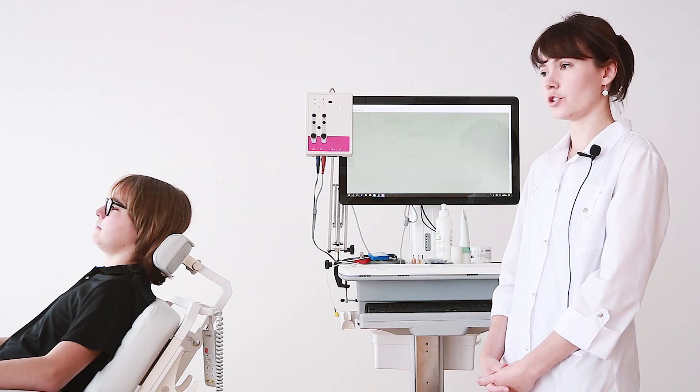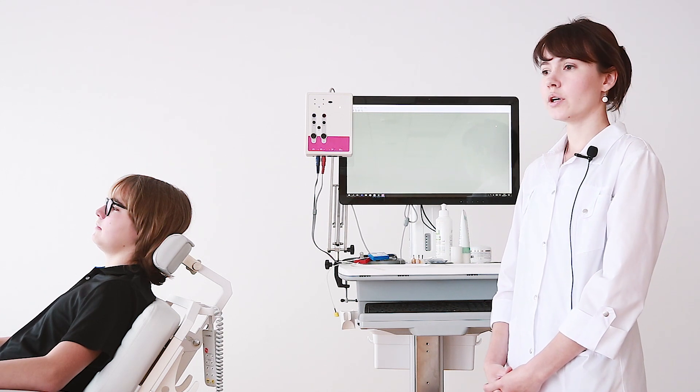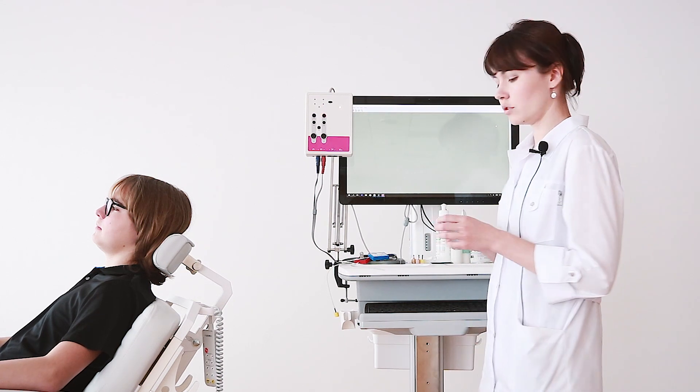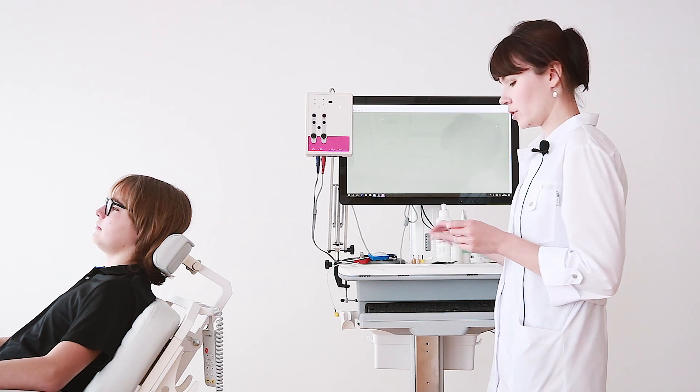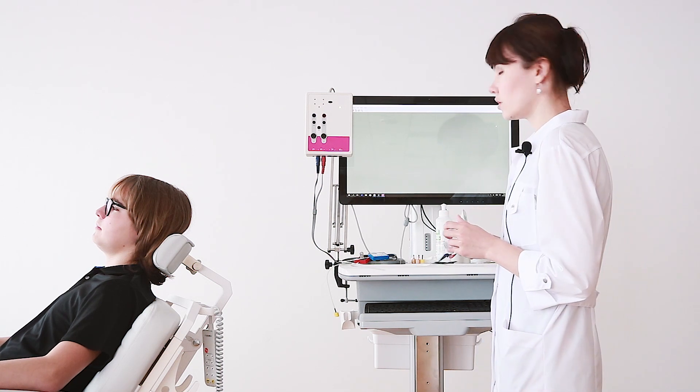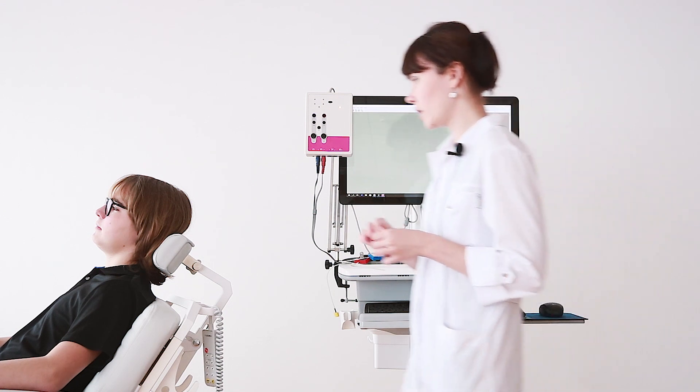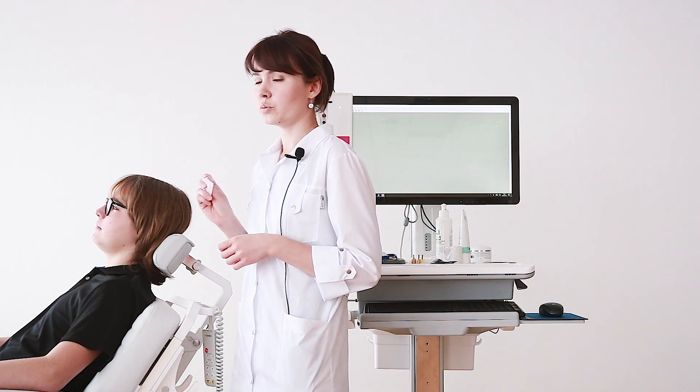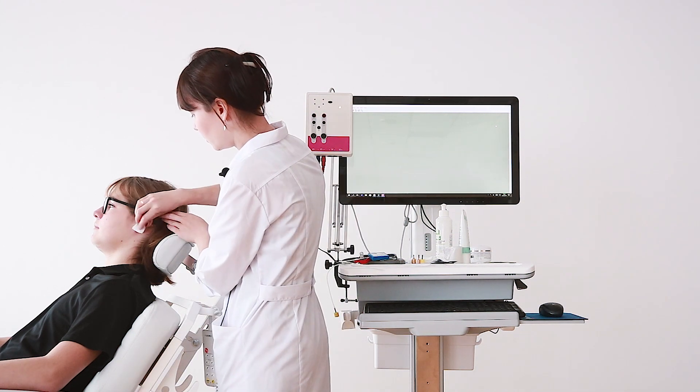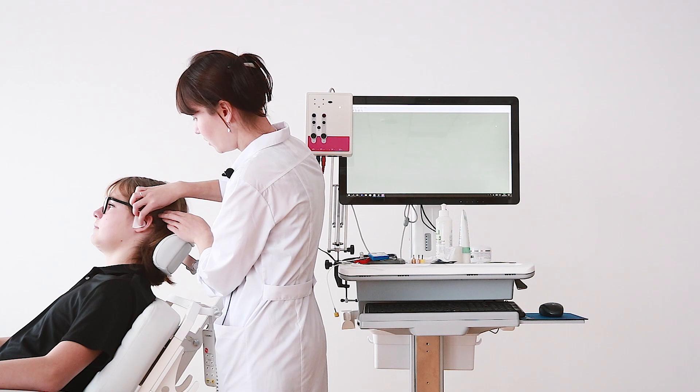Let's start to prepare the skin before the procedure. To reach good impedance during stimulation, we need to prepare it in the right way. First, we need to degrease the points of future electrode positions via an isopropyl napkin. The active electrode we will put in the left ear canal today. We degrease the skin of the ear.